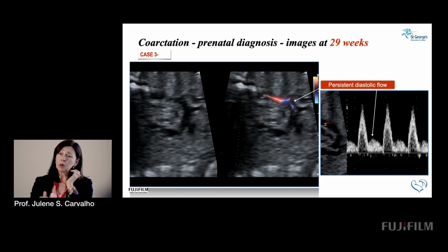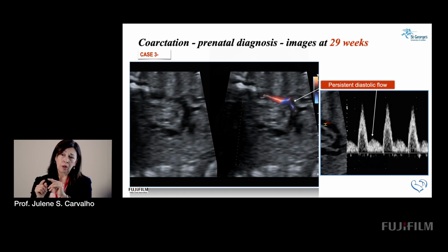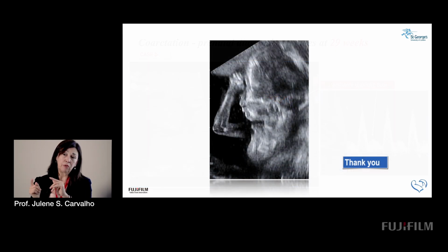Many years ago, I published a paper which was looking at the flow in the descending aorta. If you look up my name, continuous wave coarctation, you'll find a paper that is very old. But we quantified that in the child, measuring lots of things, time to peak diastolic velocity, and so on. Have a look. It's free on the internet, the paper.